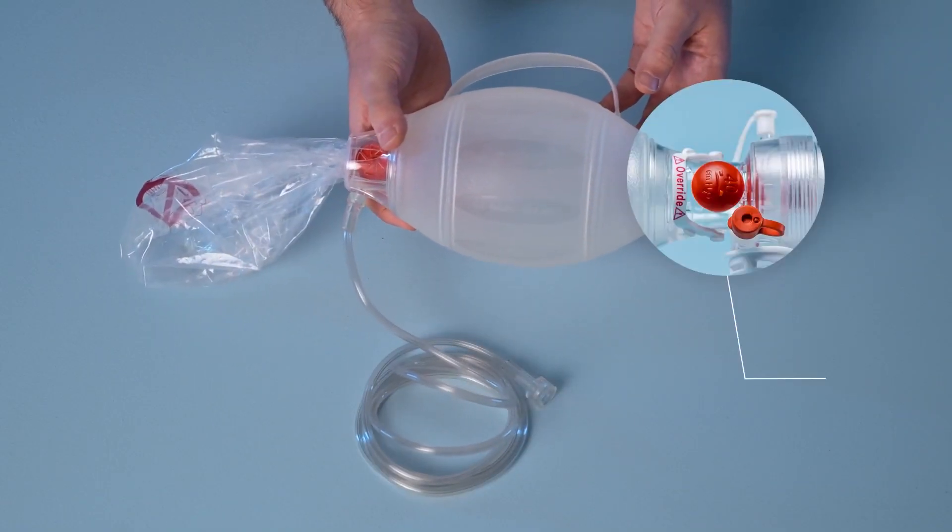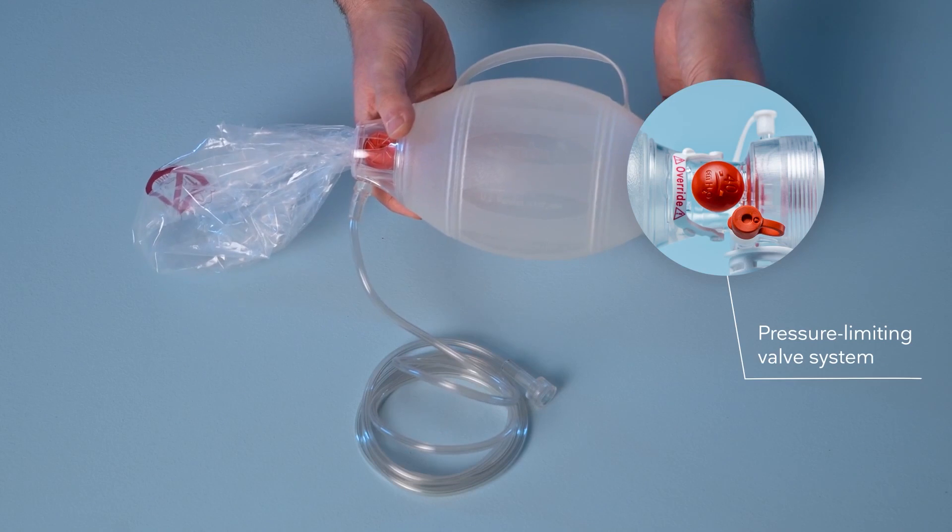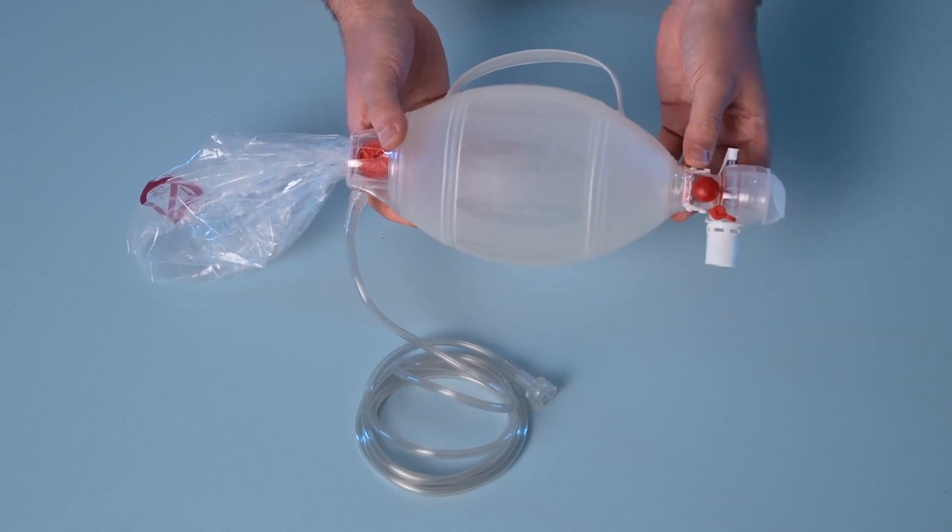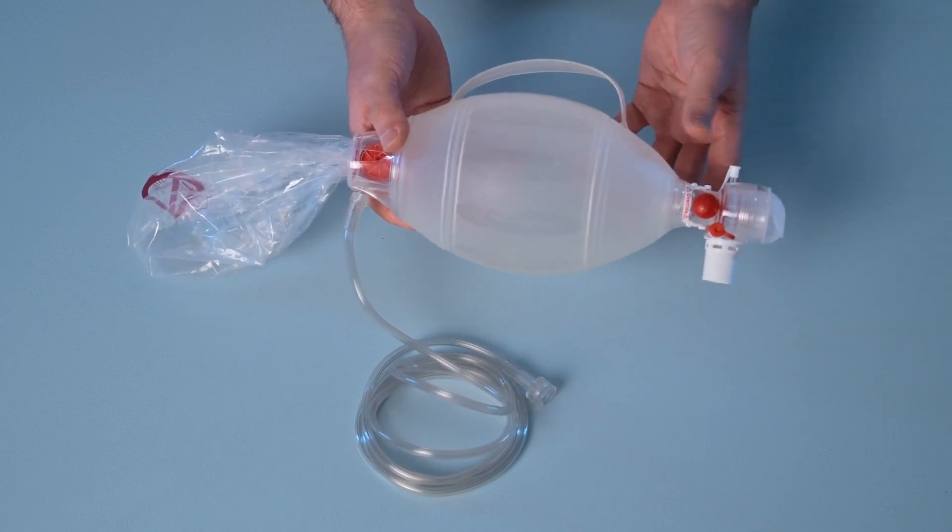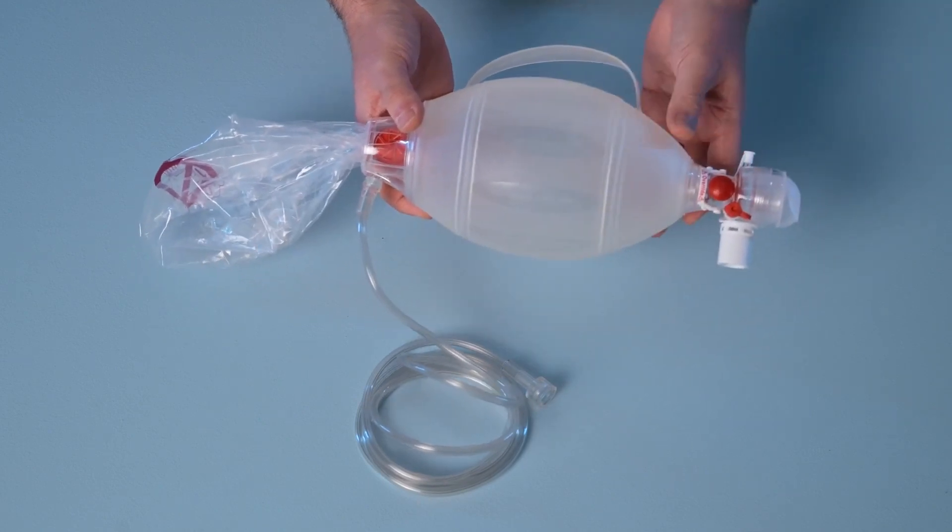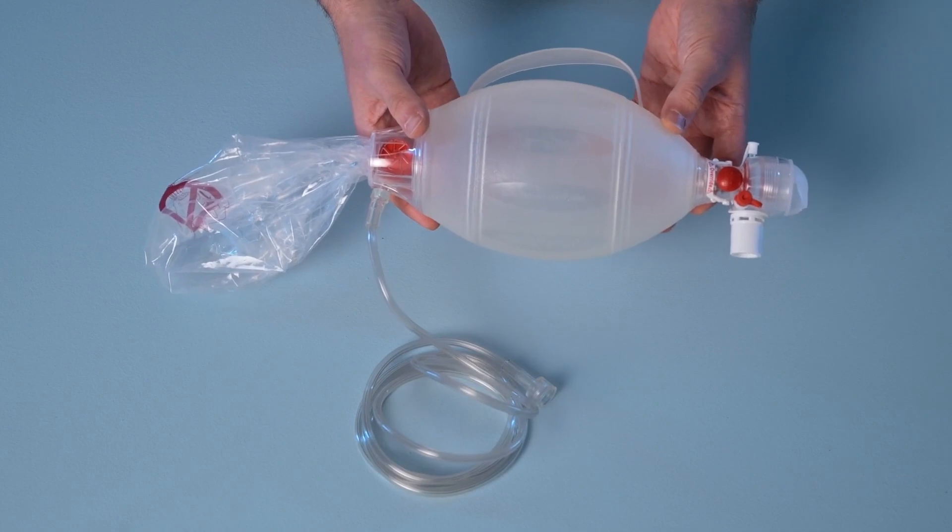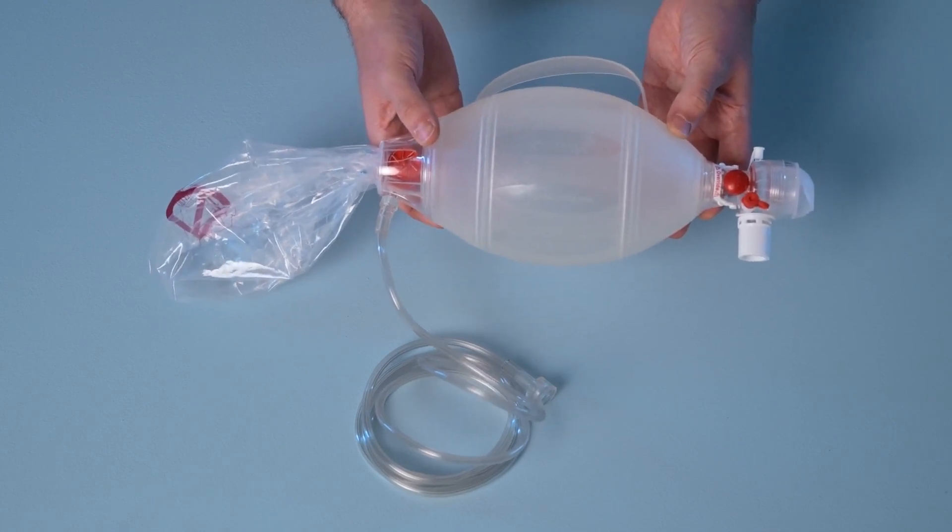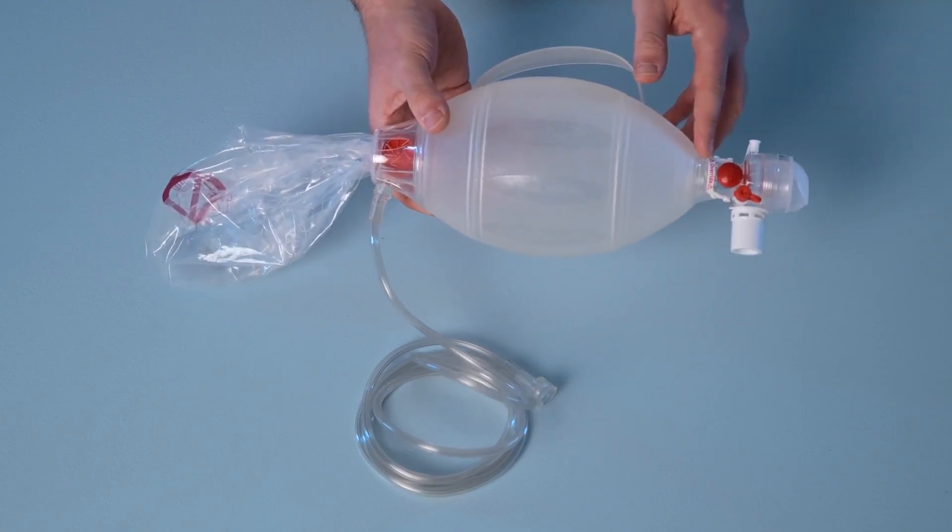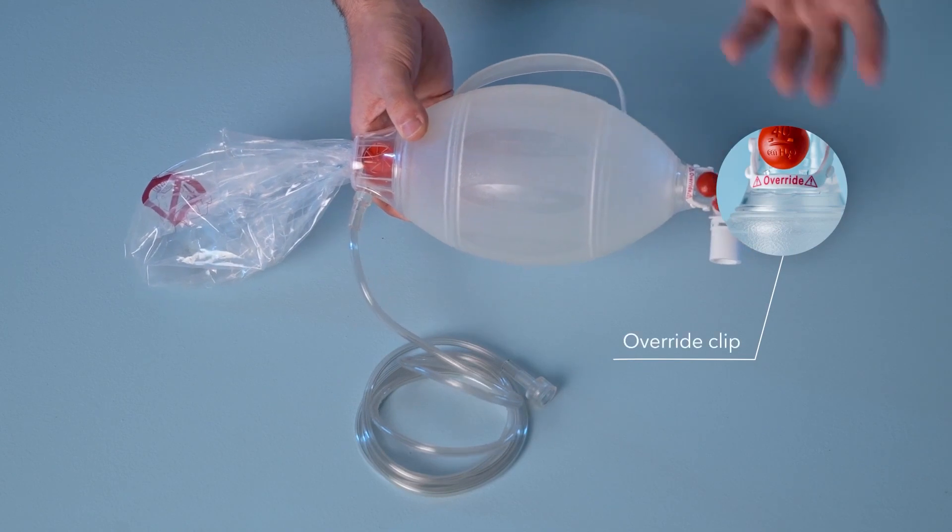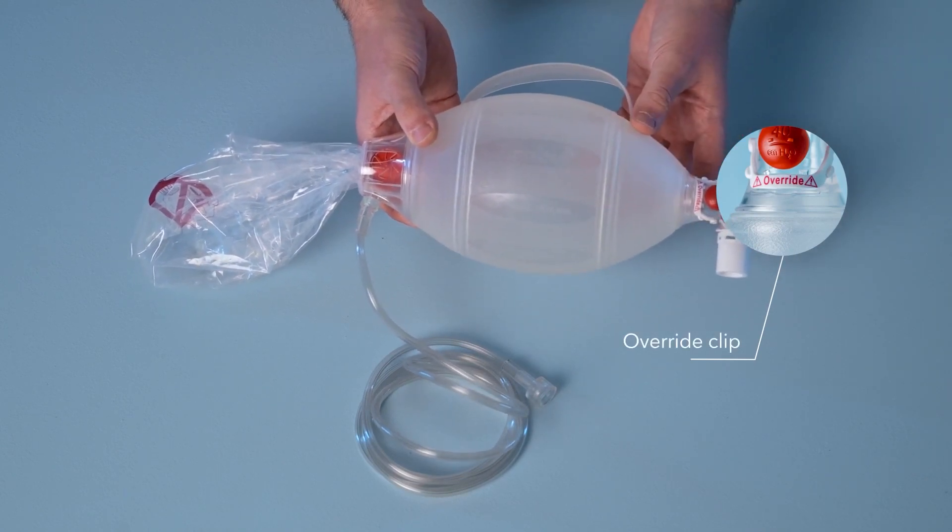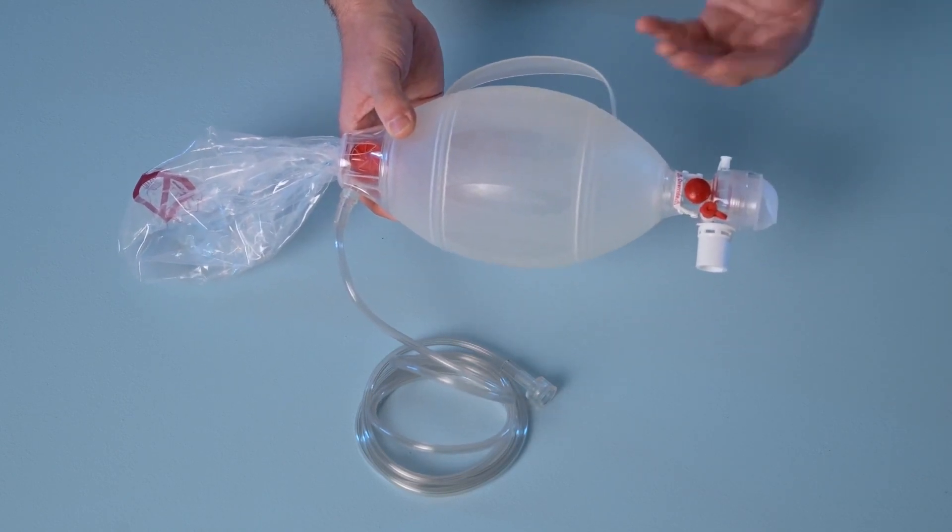Moving forward we have a pressure limiting valve system which prevents the delivery of excessive pressures to the patient. This feature is included on all Spur2 products and is designed to activate at a pressure of 40 centimeters of water. There's also an override clip which can be engaged if higher pressures are required. This clip prevents the valve from activating.